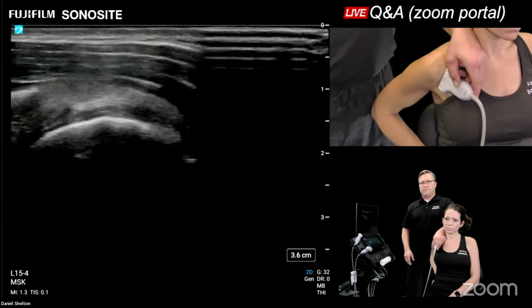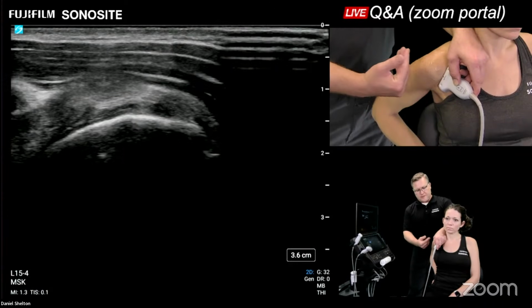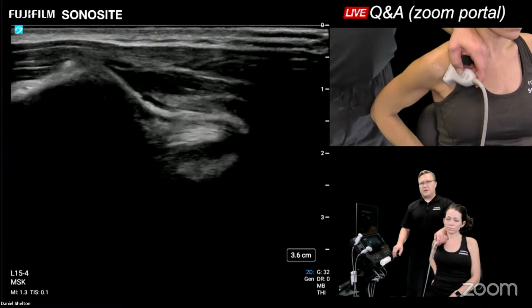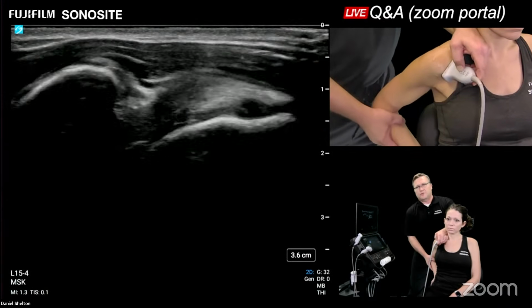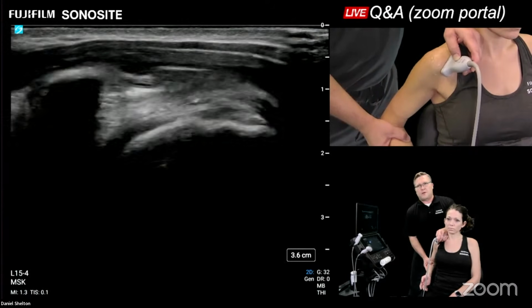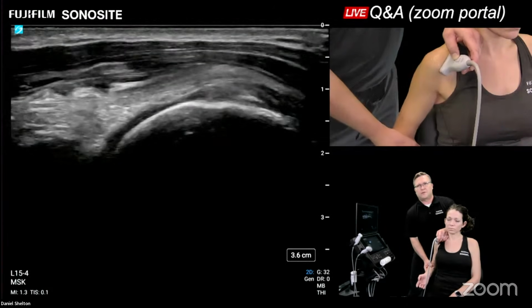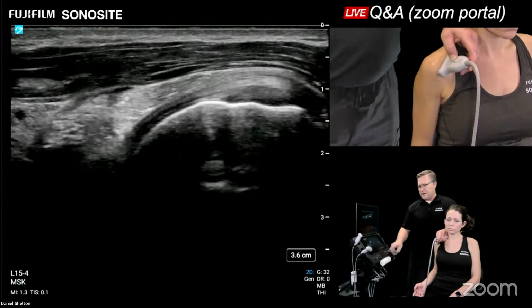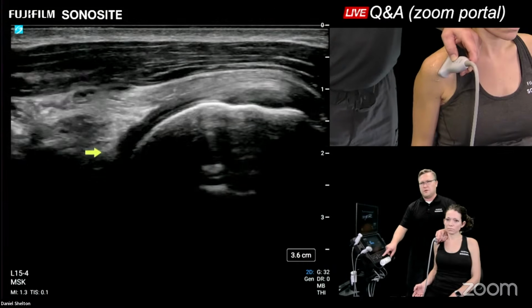So here we are. We've rotated the ball of the humeral head more anterior. The biceps groove is now right up against the chest wall. And that's what makes this exam nearly impossible to do when it's in a modified CRAS. So we're going to have her just slowly relax and find the point at which that biceps climbs out from the coracoid shadow. So I'm going to go just north of the coracoid shadow and have her slowly relax. And that should bring that anisotropy into view. There we go. So you can see that nice shadow dropping down into that superior glenoid tubercle down here.